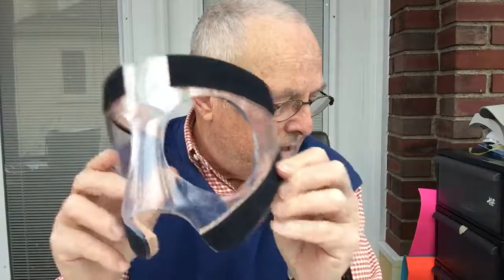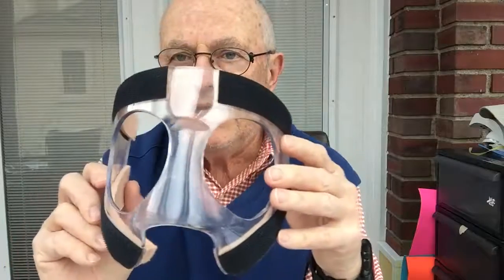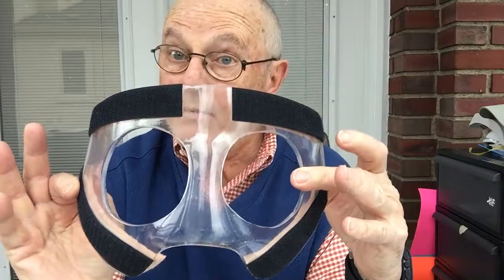Okay, so this is the Hoosier mask going to Dawn's son in Bloomington, Indiana — basketball capital of the world.